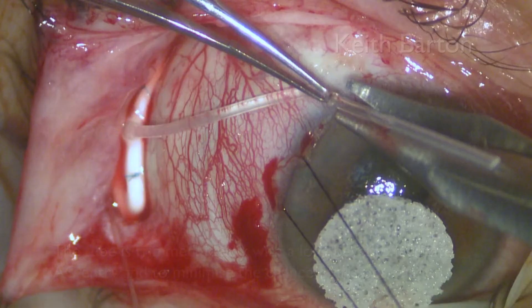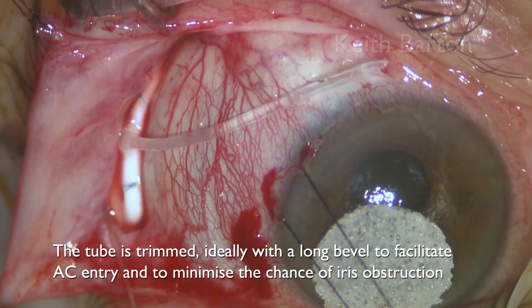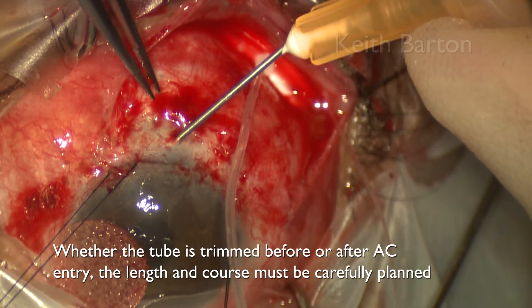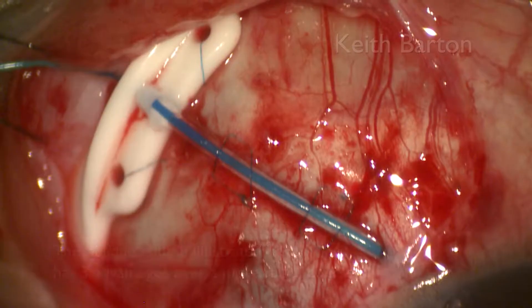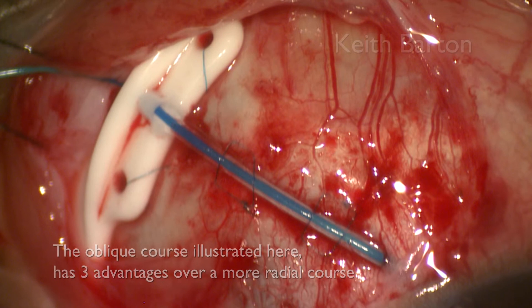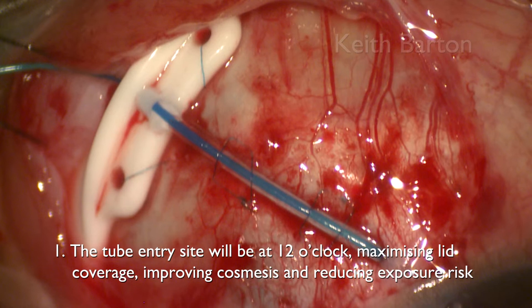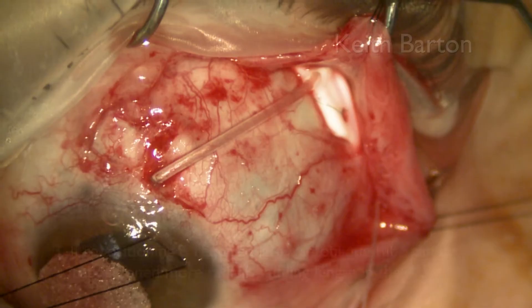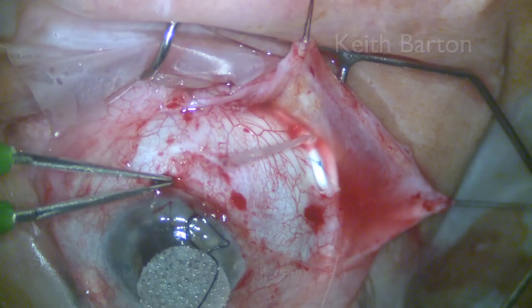The tube is trimmed ideally with a long bevel to facilitate AC entry and to minimise the chance of iris obstruction. Whether you trim the tube before or after AC entry, the length and course must be carefully planned. The oblique course illustrated here has three advantages over a more radial course. Firstly, the tube entry site will be at 12 o'clock, maximising lid coverage, improving cosmesis, and reducing the risk of exposure. Secondly, a more oblique entry reduces the bend in the tube at the entry site, minimising kinking and reducing the exposure risk. The third advantage is that if repositioning is required later, an oblique tube can be repositioned more radially, adding length in the anterior chamber.